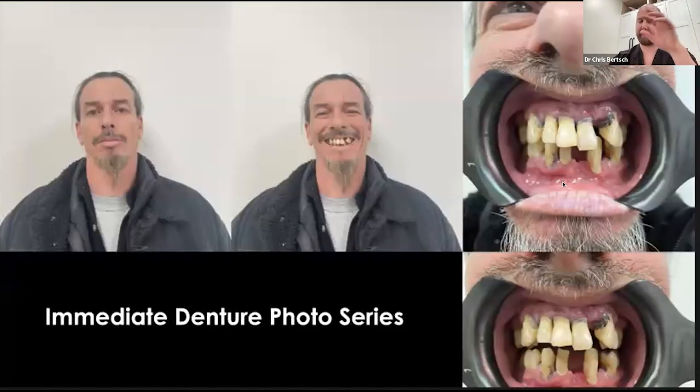So at the very beginning, I commented at my consult, I take photos, and I started doing that because the result is just incredible. It's so much better. I had a denture, the last one where I didn't send pictures, the patient ended up looking like a horse. So I had to adjust and pivot and get that fixed. But now that I send pictures, and this is the 4 that I send, well, I don't normally send one with their mouth closed. I don't know why that one made it there. But anyways, I send the smiling and I send these 2 pictures to the lab. And it really gives them a reference and helps them understand who these dentures are for. And it's insane, like how beautiful they are after. So that's the pictures I take.